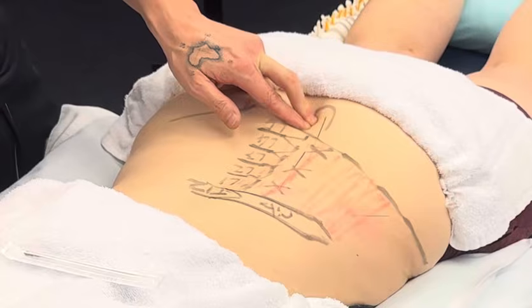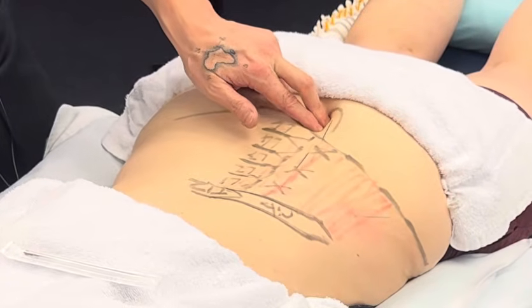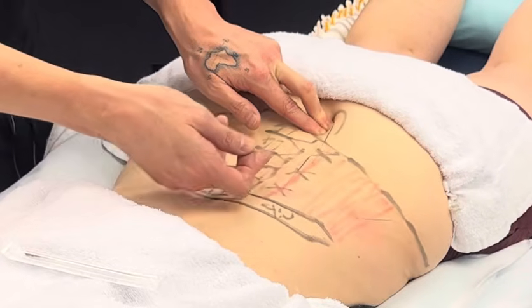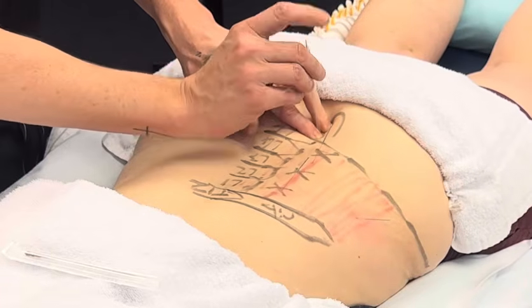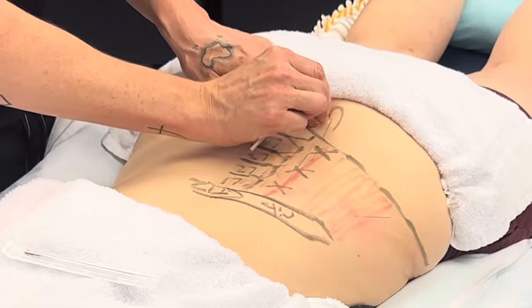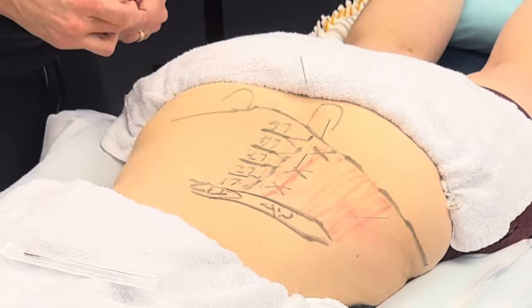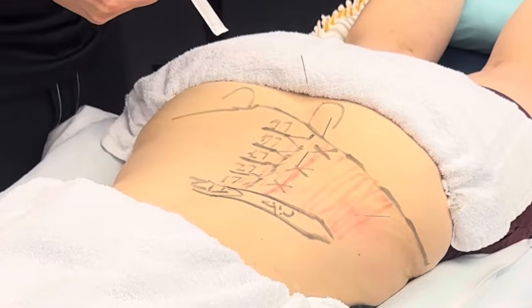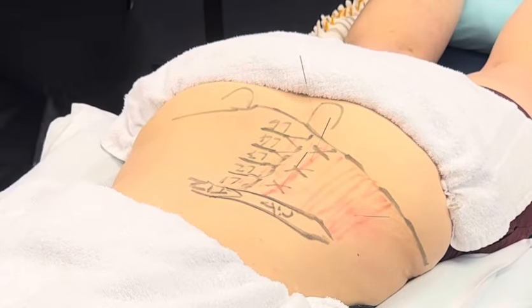And you can feel that SI ligament. It runs like this. It's a big old ligament, right? You should be able to kind of roll over it. You also have some paraspinal and some multifidus tendon coming down there. And you just needle full depth onto the sacrum. Does that surprise you? The sacrum is not as shallow as you think. There's some tissue there and stuff like that. Okay, let's do one more.